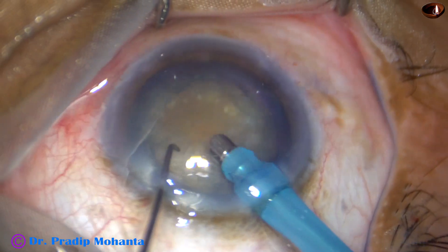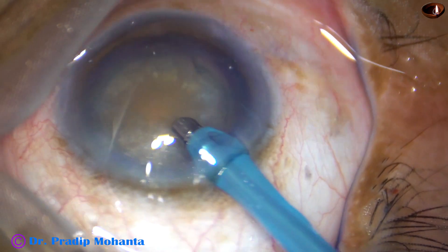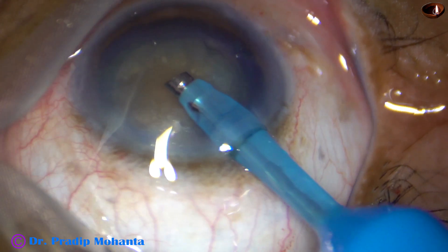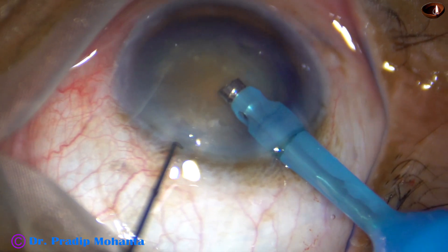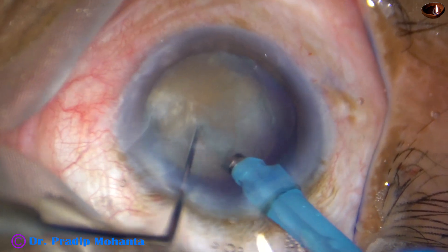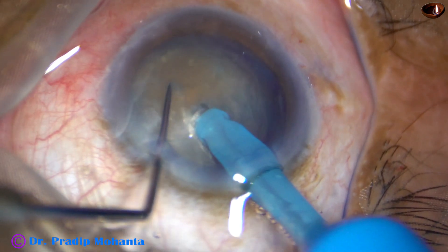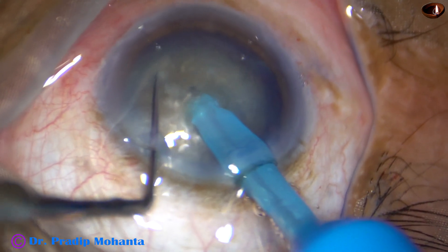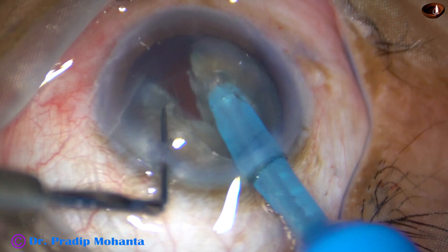Let us see the nucleus management in this case. Some superficial cortical lens matter has been removed. Now the handpiece is turned, bevel is off. And now I am going to divide this nucleus into two hemi-nuclei. I go through the substance of the nucleus towards the opposite equator. This is quite a hard cataract, so I go near the opposite equator and then chop it.